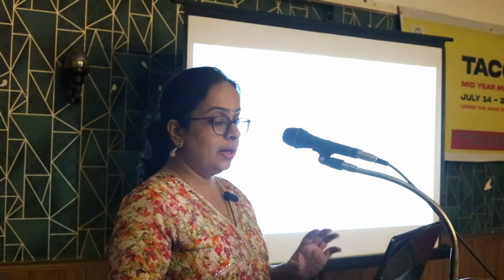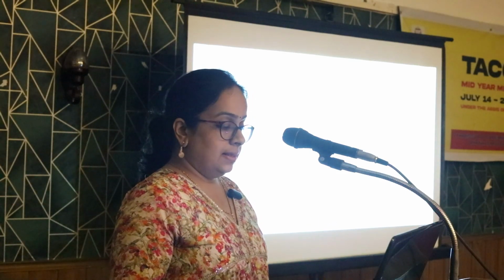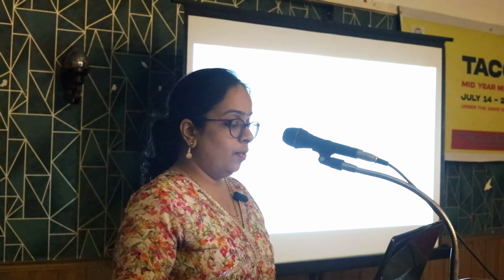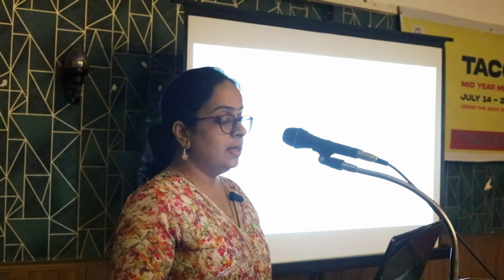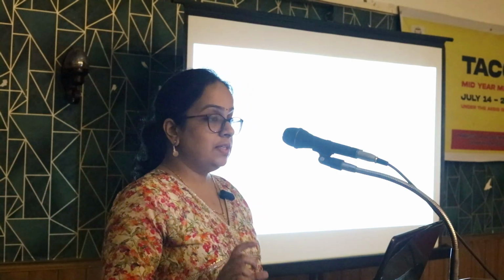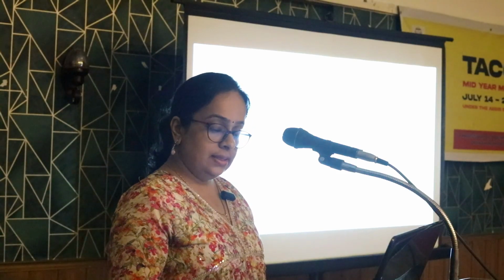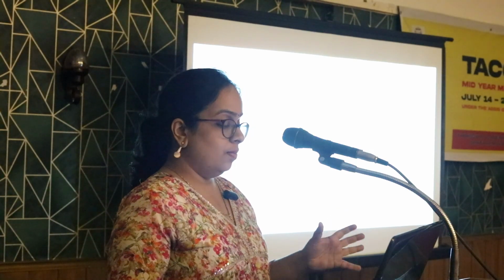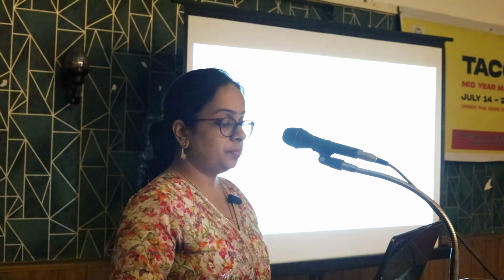So to get that, only the nasal part is scanned up to 30 degrees. Then there is the 10-2 with 68 points within 10 degrees, and the macular threshold or 5-2 with 16 points. And there is 24-2C, which scans 24-2 with additional test points at the center, almost like combining 24-2 and 10-2.